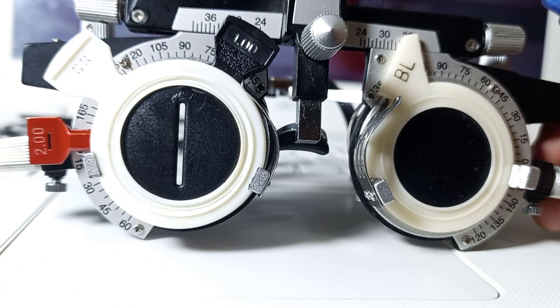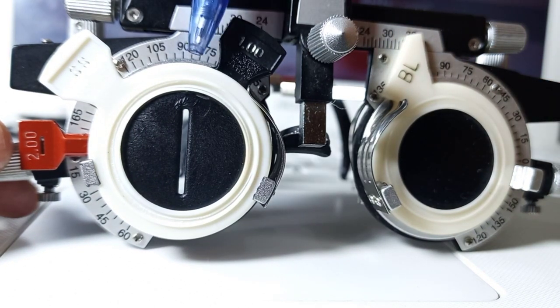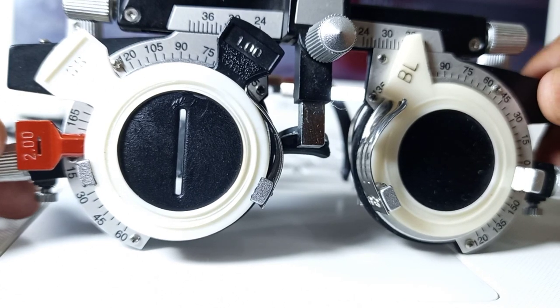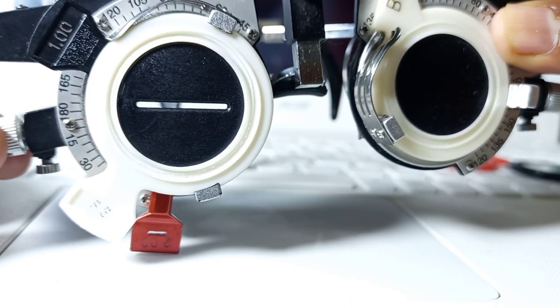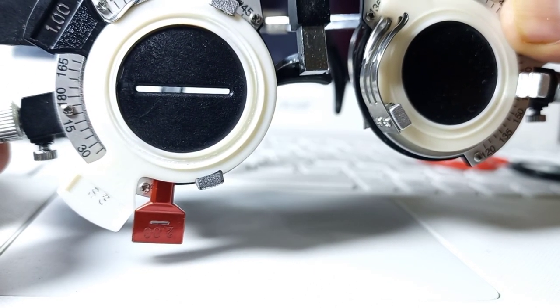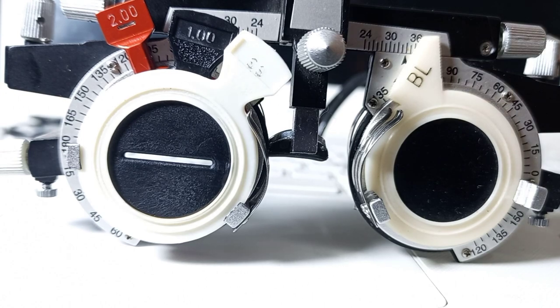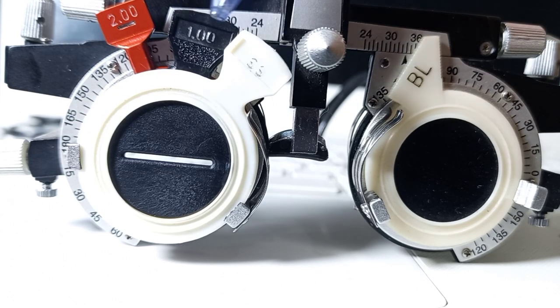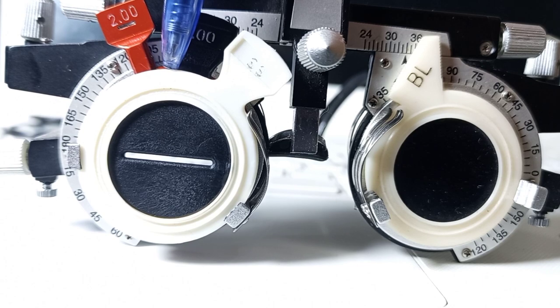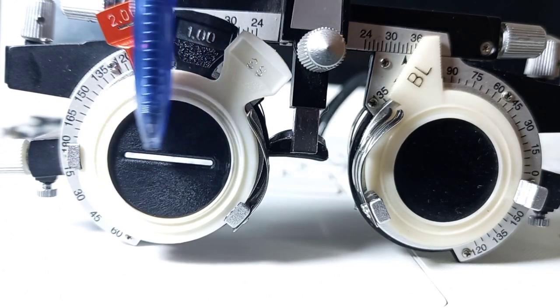The next step is to rotate the stenopic slit 90 degrees apart. Right now at our first principal meridian the stenopic slit is coinciding with 90 degrees, so now we will rotate it to 180 degrees. The visual acuity of the patient will get blurred. The reason is that we have cleared the first principal meridian at 90 degrees — that was the axis meridian. Now we need to clear the second principal meridian at 180 degrees, which is the power meridian.